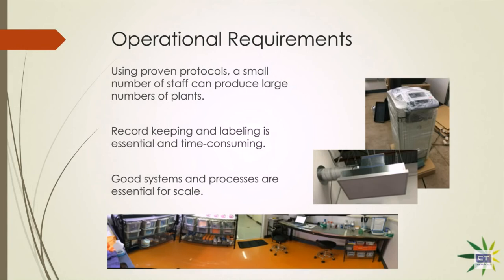Okay. Here's another question. Can you use UV sterilization over an autoclave? UV sterilization works in many contexts. However, it depends on the chemistry of what you're sterilizing. UV is a good sterilizing agent because it attacks molecules and breaks chemical bonds. So if you've got something in your medium that is sensitive to UV and has particular bond structure, it may be disrupted or chemically altered by the UV. However, the same is true of heat. If you heat your stuff, you may get byproducts. So you just have to optimize your process. The answer is, in general, you might be able to do it, but it may cause problems with some of your constituents. The same can be said of heat, but those techniques are well known and solved through proper formulation. Probably you would have to do the same.